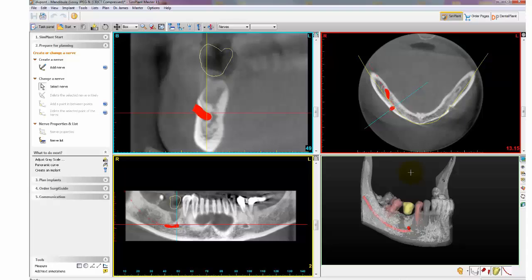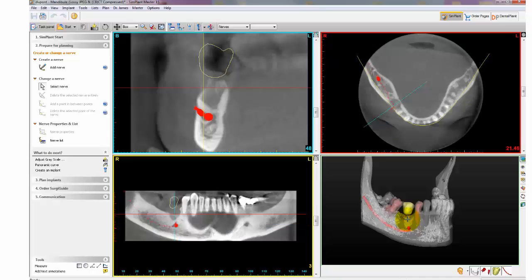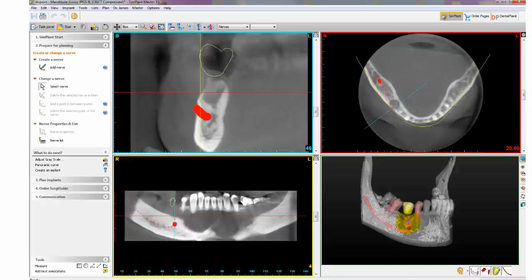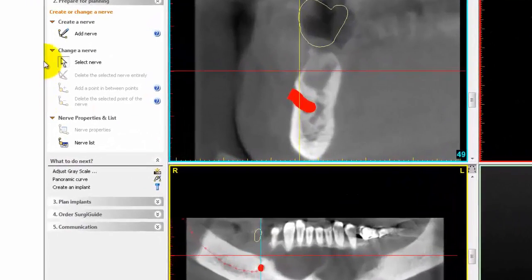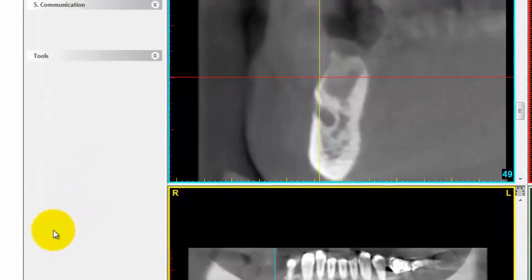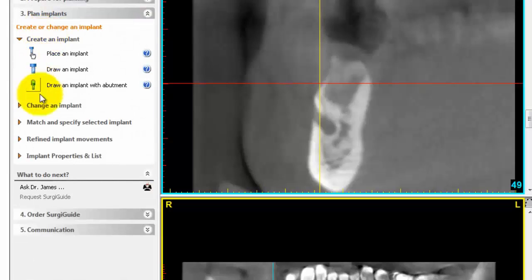Now let's place an implant. Click Plan Implants, then Create or Change Implant, and Draw an Implant.